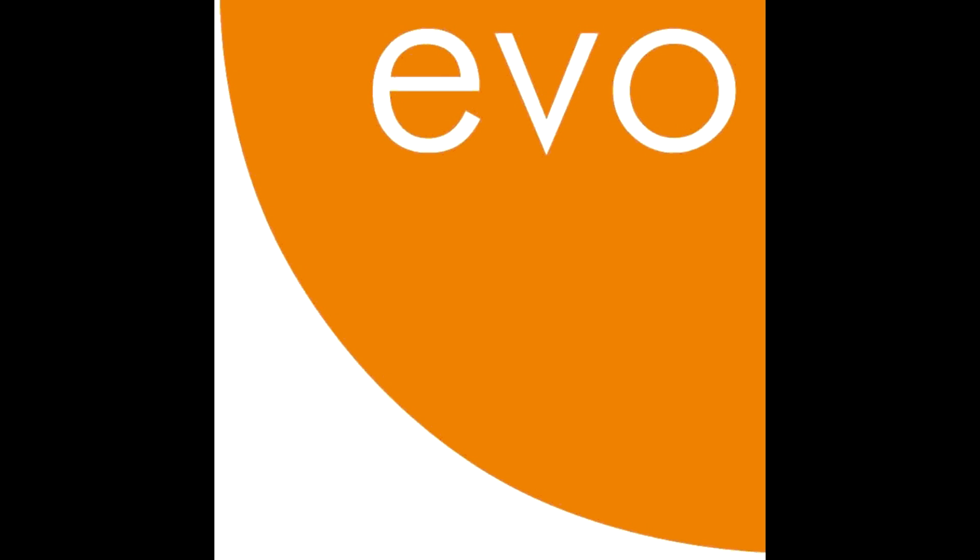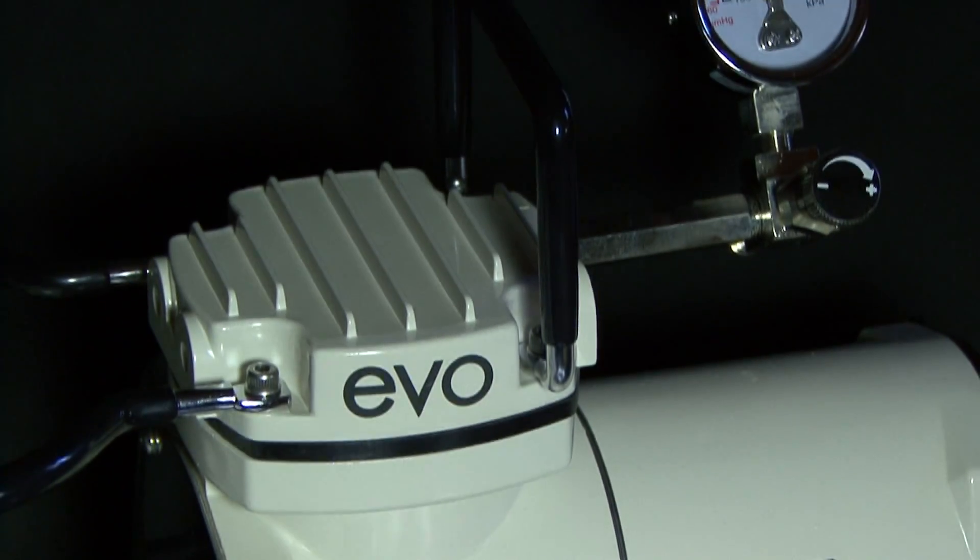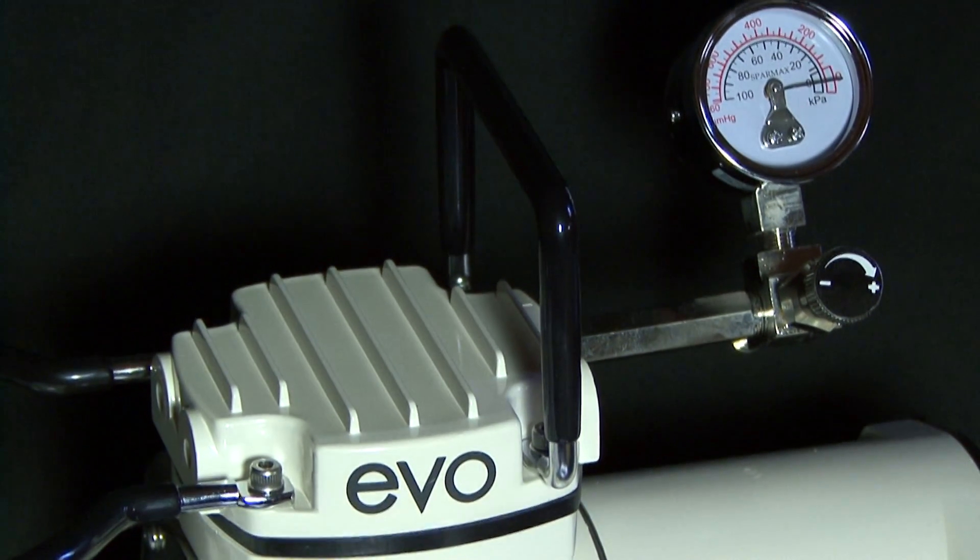In this video, Evo Medical Solutions is going to give you a step-by-step process walking you through the assembly and functions of the Medi Aspirator 606 Suction Unit. The Medi Aspirator is the ideal suction unit for inpatient and outpatient care requirements. It features high performance vacuum specification and a durable piston type compressor with a very easy to read gauge.